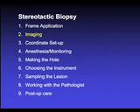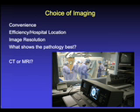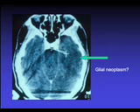Now we'll discuss imaging. The choice of imaging is dependent upon how the lesion is best imaged, convenience, image resolution, and hospital location. At the University of Pittsburgh, we have an intraoperative CT scanner that we use for stereotactic surgery. At most facilities, however, the CT scanners will be in the radiology department, along with the MRI scanners. Most lesions are well seen on CT. Some lesions best seen on MRI are more suitable for MR-guided biopsy.